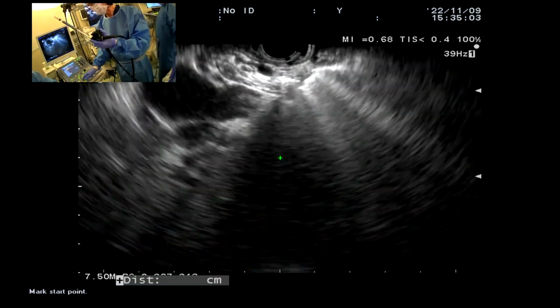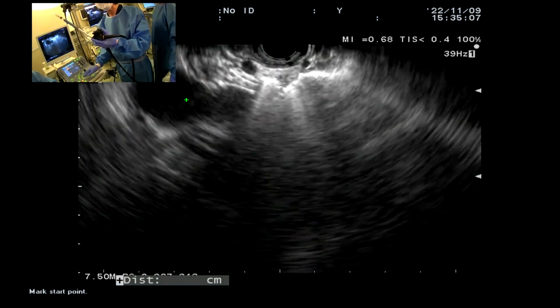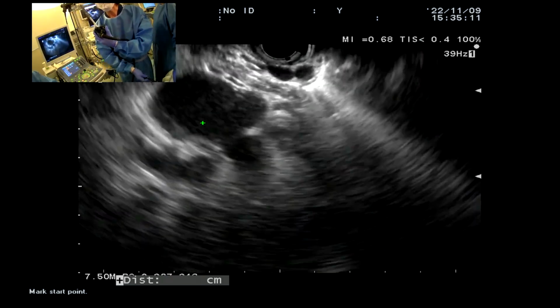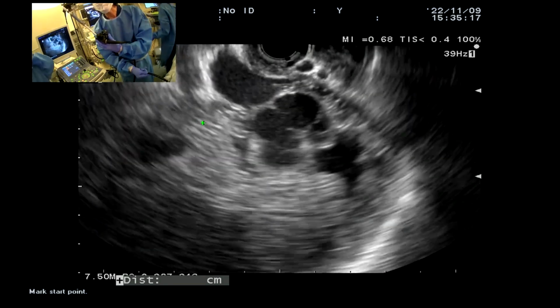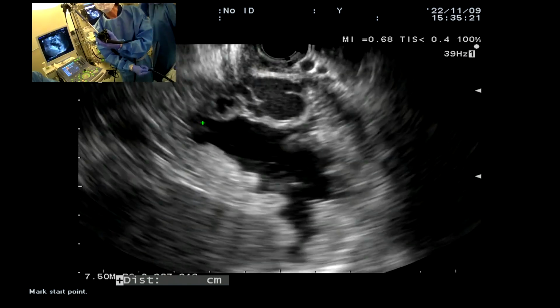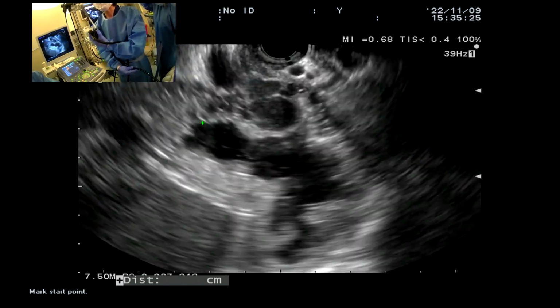Now, this is not what we were going to target. This is a collateral outside. This is the Crus muscle here. I'm going to torque a little bit, and then I'm going to have the assistant hold the position for a moment. So here's the big fundal varix. There it is. So we want to come in the backside. There's the fundus with the water in the fundus. So hold this, please.